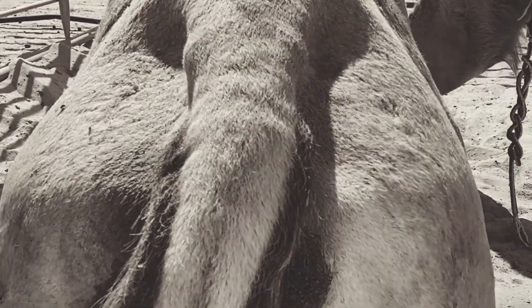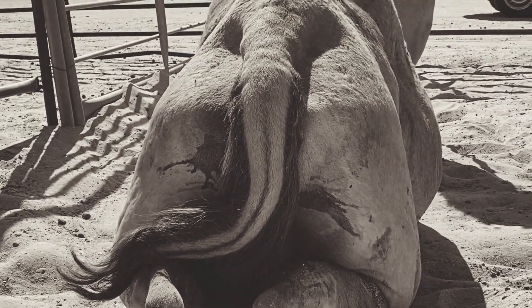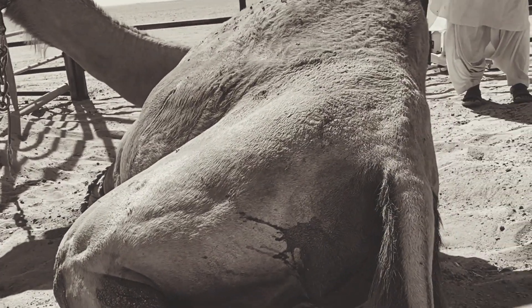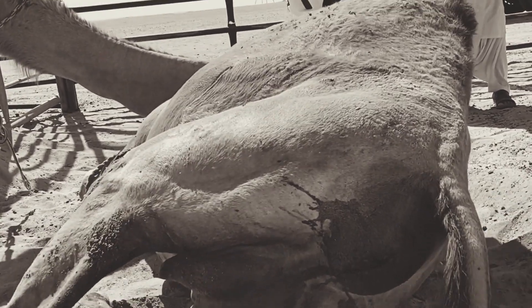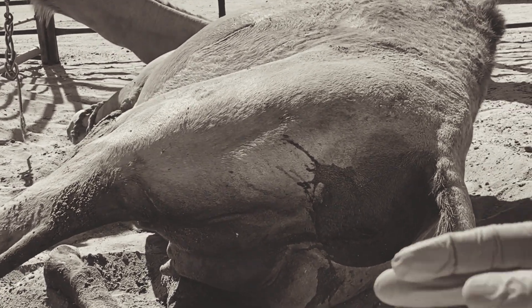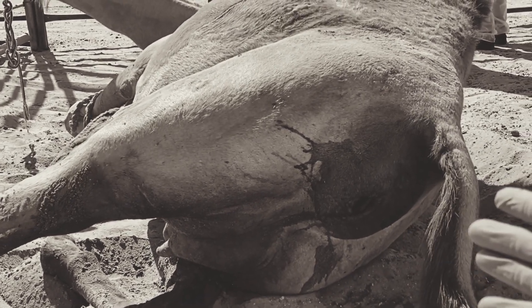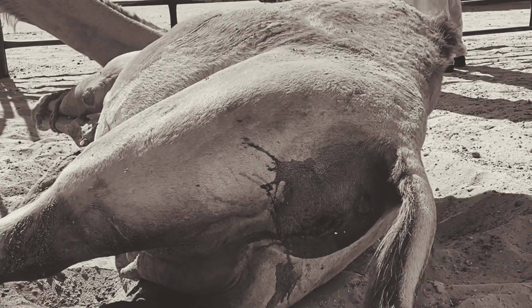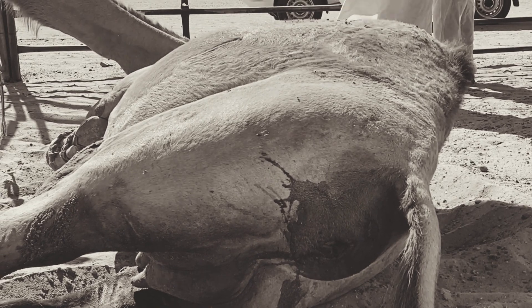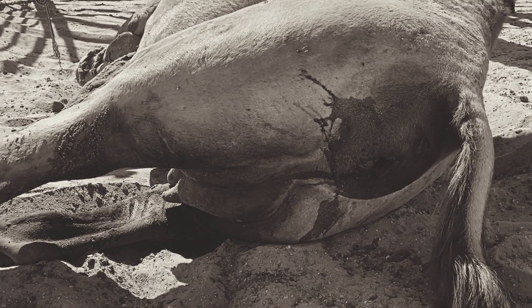So we're going to examine it first, and then we'll see if we can expel the fetus whole. If not, we will perform fetotomy — we will dissect the fetus from inside the uterus. I'm warning you guys, this is graphic content. I'm going to record it as a time-lapse so you'll see the activity, but this will be a long procedure, so bear with me.